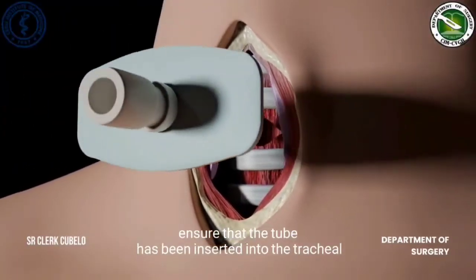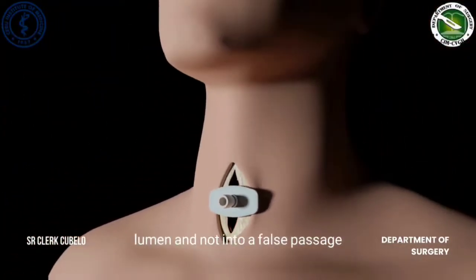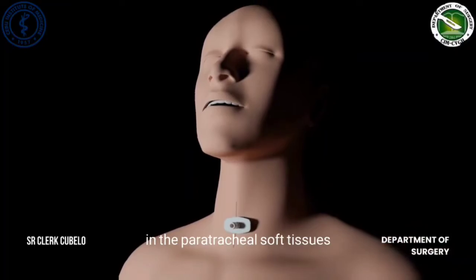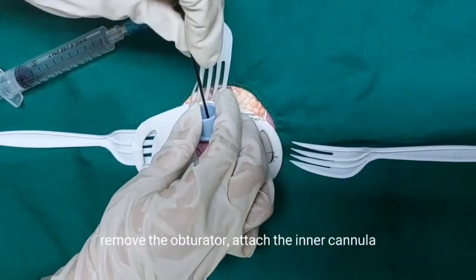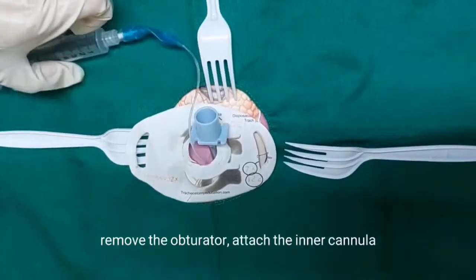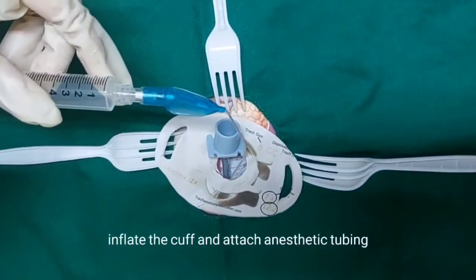Ensure that the tube has been inserted into the tracheal lumen and not into a false passage in the paratracheal soft tissues. Remove the obturator, attach the inner cannula, inflate the cuff, and attach anesthetic tubing.